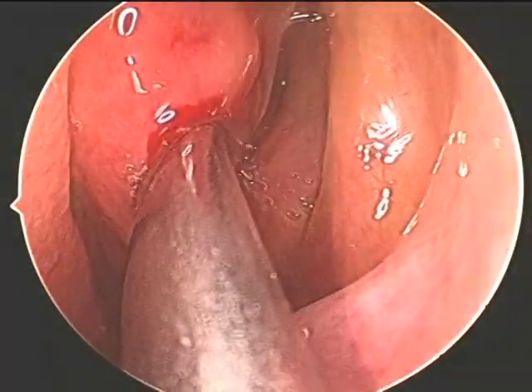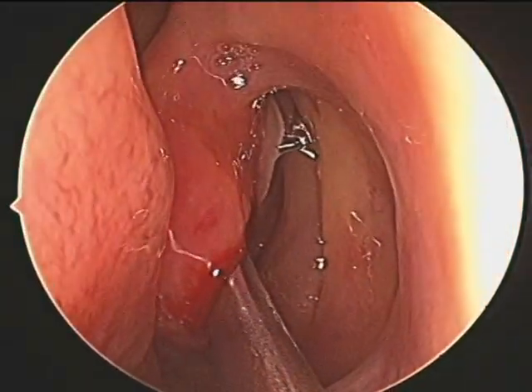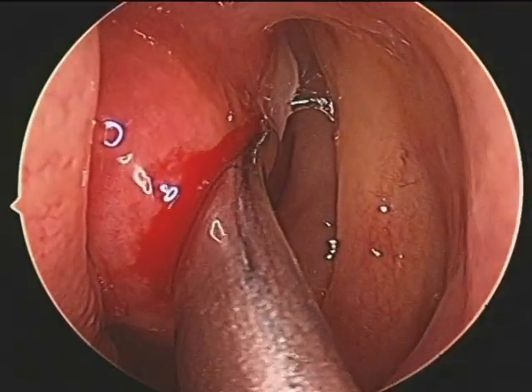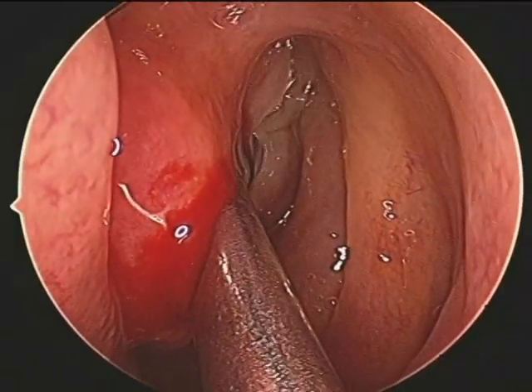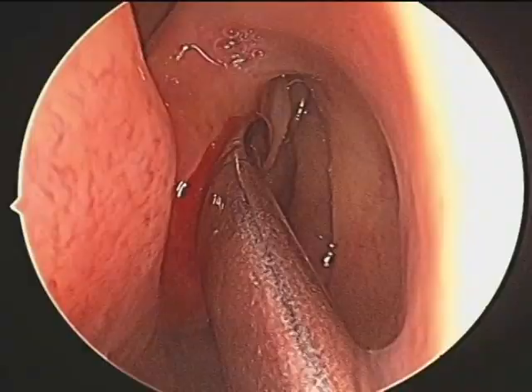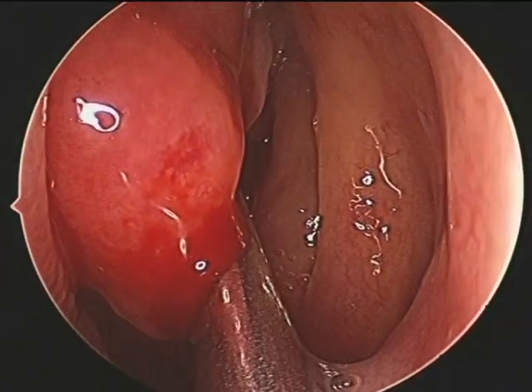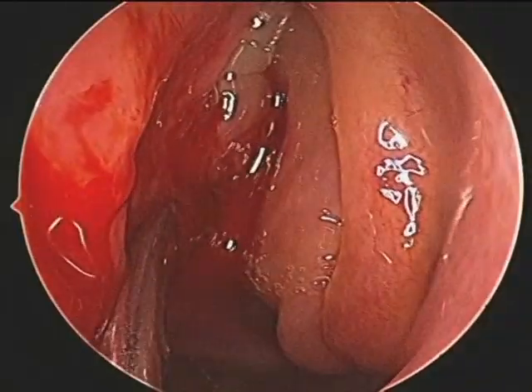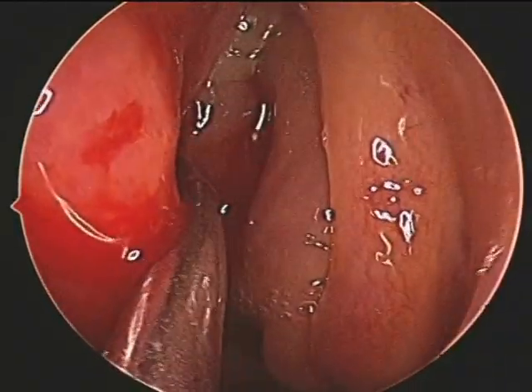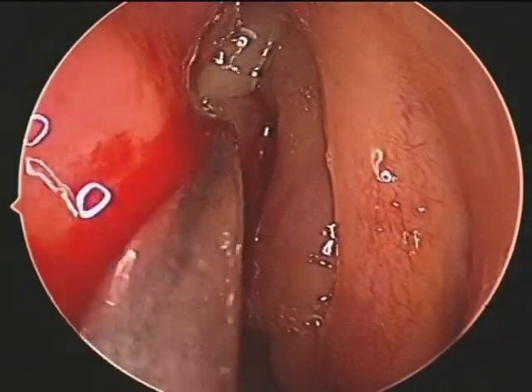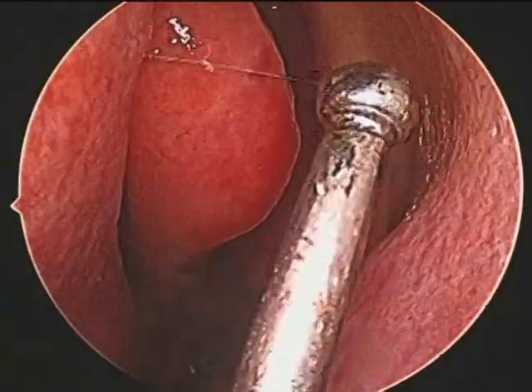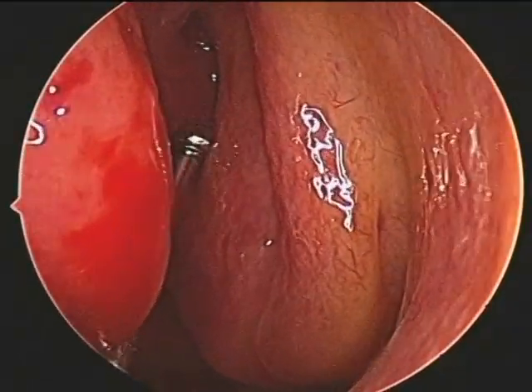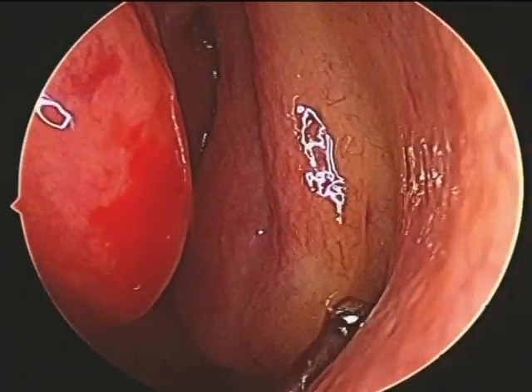We are now medializing the middle turbinate onto the septum to create space for the surgical operation. We decided to compress that small concha bullosa since on the CT it shows that it is not diseased. We can see the uncinate process laterally — that is the ground lamella and that is the bulla ethmoidalis, with the uncinate process laterally.